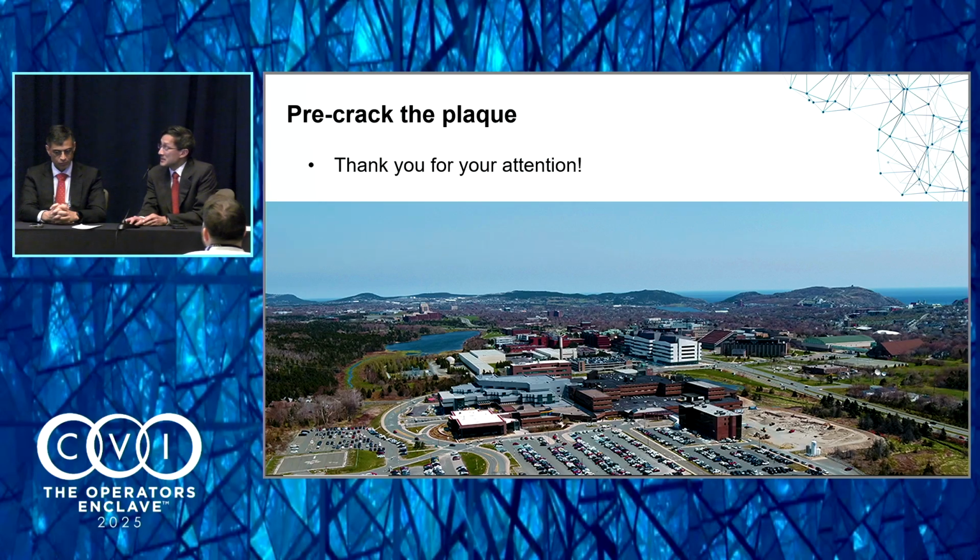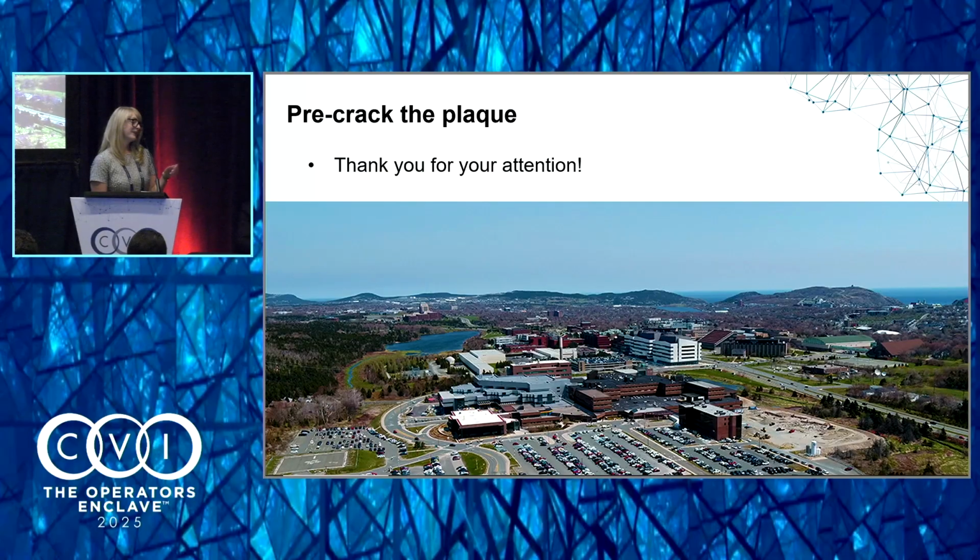Question for you on the case that you showed where you had to go distally. Were you able to use the same balloon multiple times, or did you pull out a new one? I did actually for the OPN. I did use the same 1.5, but it's a good point. Sometimes when you've already inflated a balloon, whether it's an NC or an OPN, it can be more difficult to deliver it that second time. So you would just have to take a new device if that's the case.